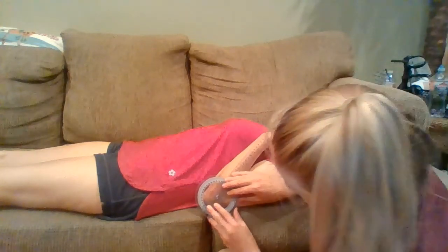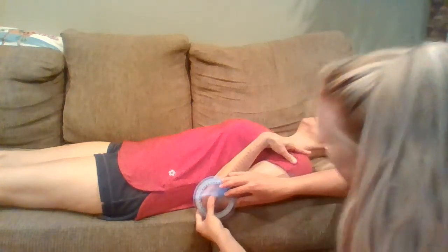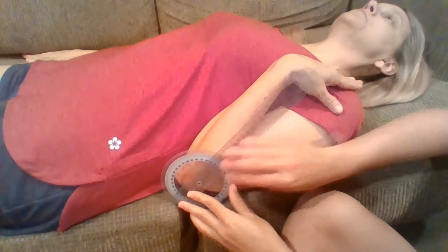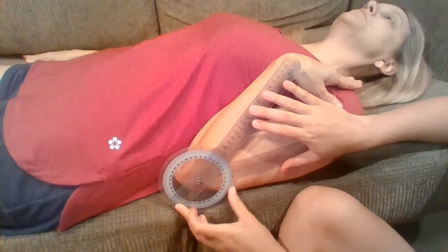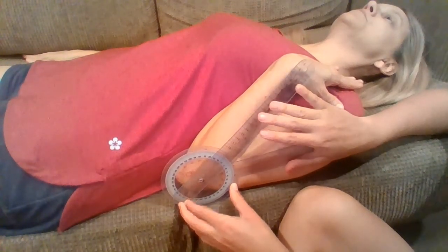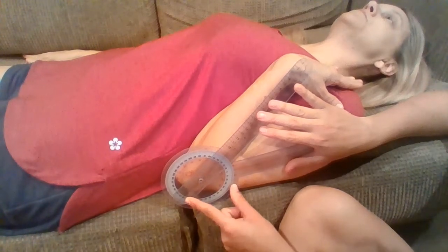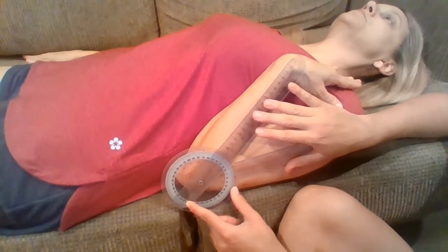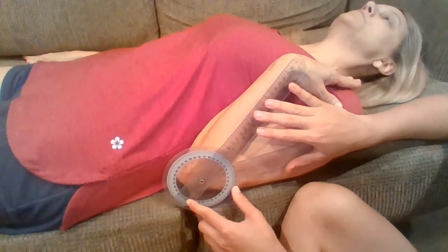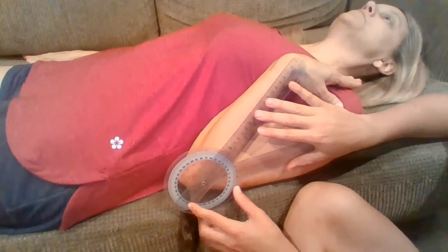Yes. All right. So we're still at the lateral epicondyle. And if I move a little bit closer so that we can see the measurement on here, she was able to achieve a joint angle of about 145 degrees of elbow flexion on her left elbow. Now we are going to measure the exact same way on her right elbow.